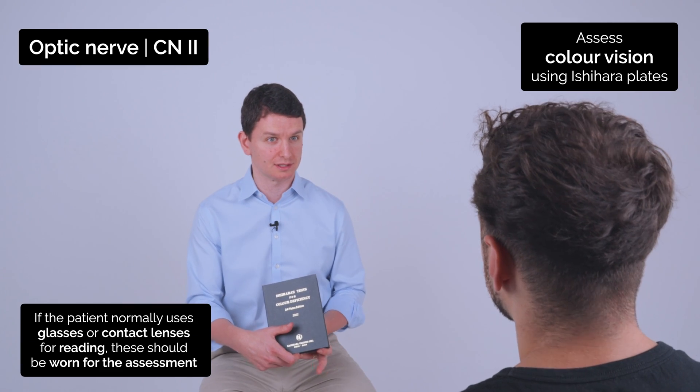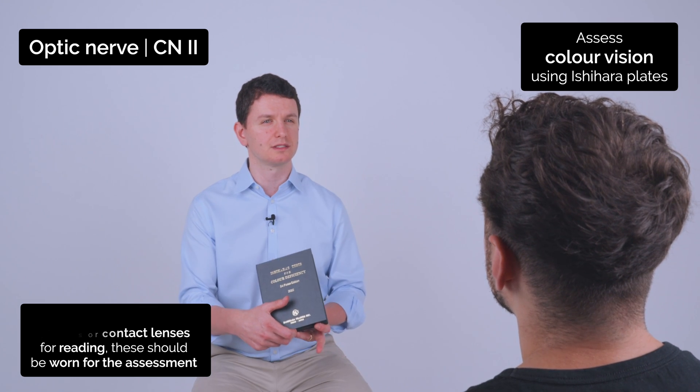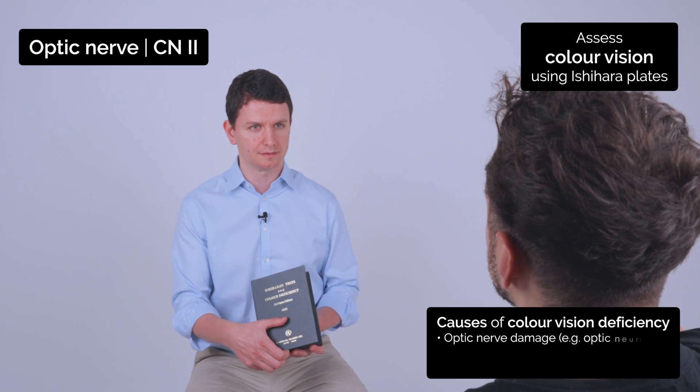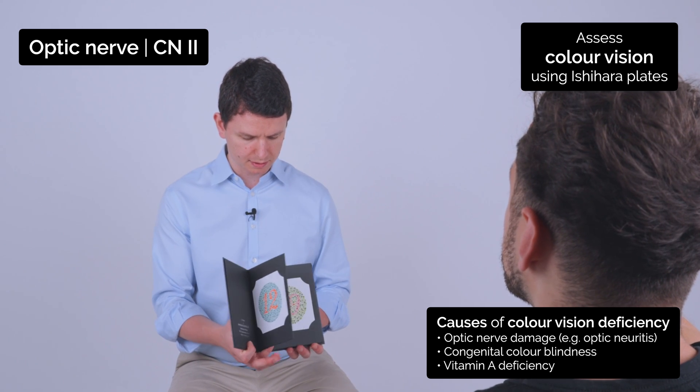I'm now going to test your colour vision. It's going to involve me asking you to read some numbers on some plates I'm going to show you. Can you start by just covering your right eye for me? And can you tell me what number you can see? Twelve. Okay, great. Perfect.